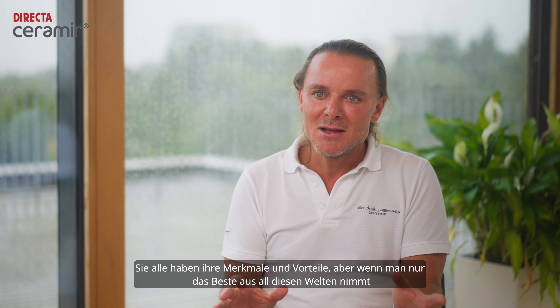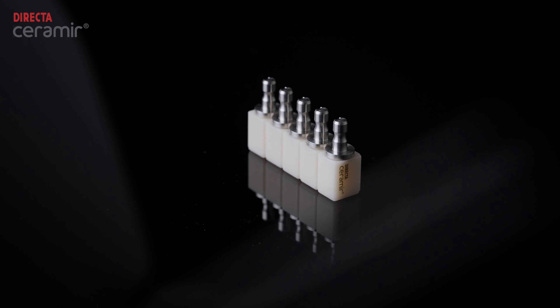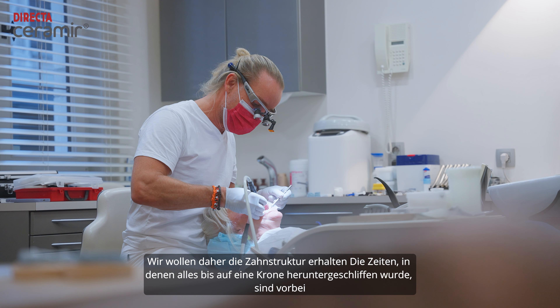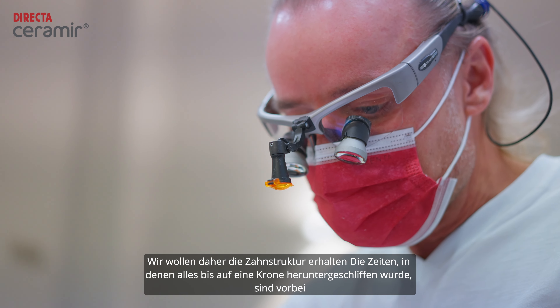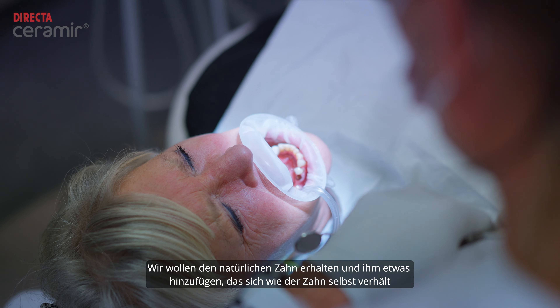They all have features and benefits, but if you just grab the best out of all those worlds, then you end up with the Ceramir CAD CAM block. We are always looking to be very minimally invasive. We want to keep tooth structure — the times where everything was cut down to a crown are over. We want to keep the natural tooth and add something to it which behaves like the tooth. So with the restorative material, we correct function and we add aesthetics.